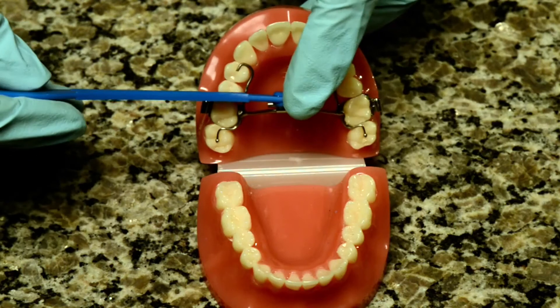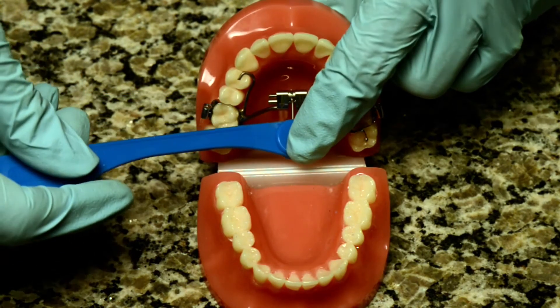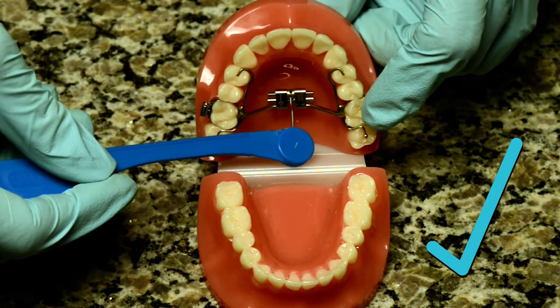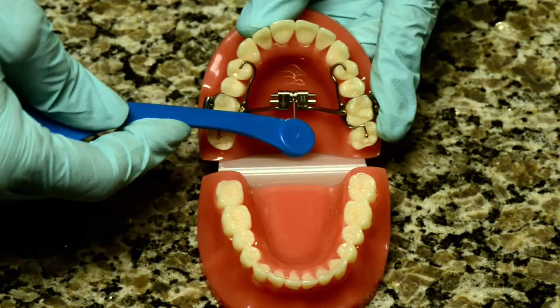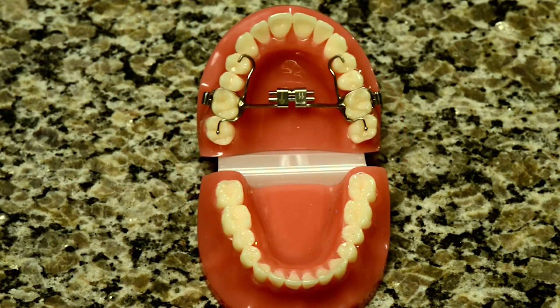Once you have pushed the key to the back of the throat, check that you can see the next hole. If you cannot see the next hole, you have not pushed back far enough. If you can see the next hole, wiggle the key gently out of the mouth — you will then have completed one turn. When removing the key, be sure not to pull back towards the front of the mouth, as that will reverse the turn you just completed.